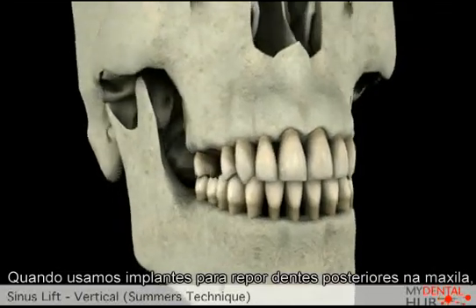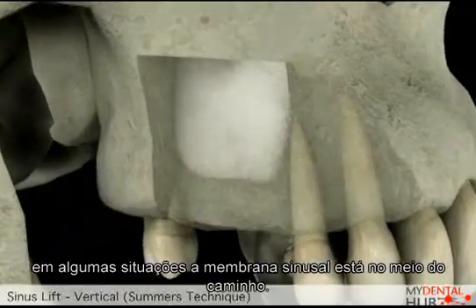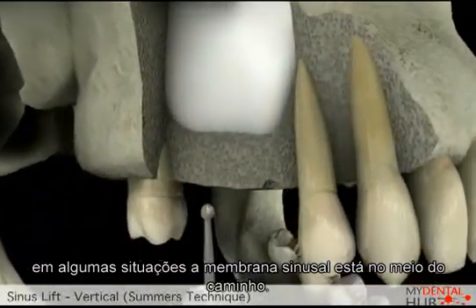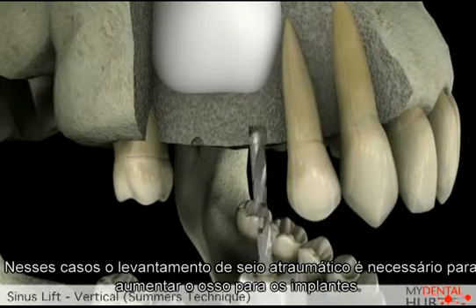When we are placing implants to replace the back teeth in the upper jaw, in some situations, the sinus within the jawbone is in the way. In these cases, a vertical sinus lift may be required to provide enough bone to place the implants.